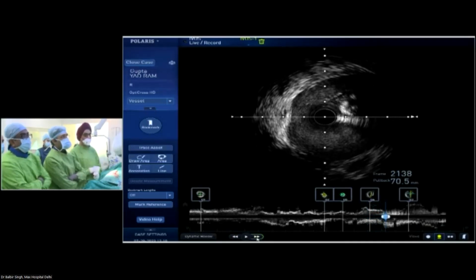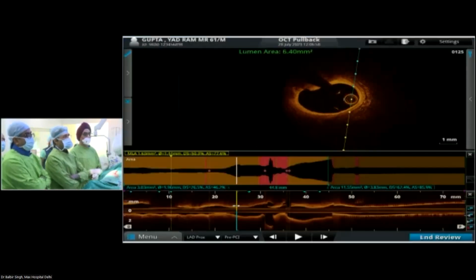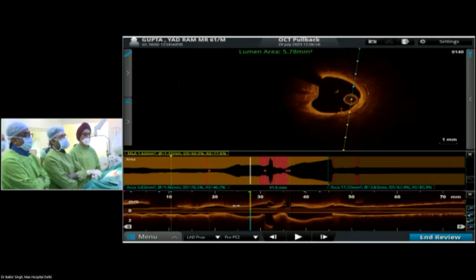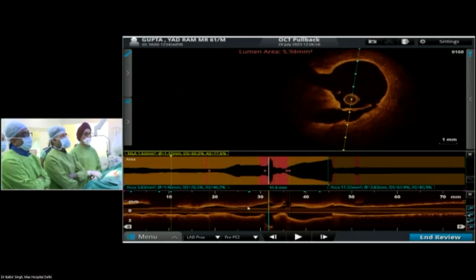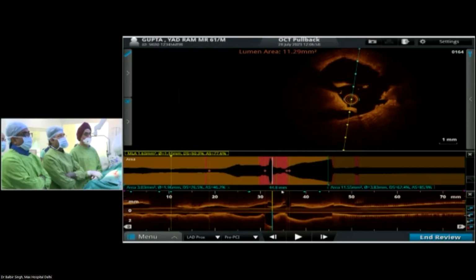Now we show you the OCT. Go to the OCT now. I also could not find any 360. I just find a nodule. Go forwards, take me near the left main, show me where the nodule is. So you see this nodule protruding into the left main. Go forwards. This is the nodule. Yeah, very, very clear. Thank you.